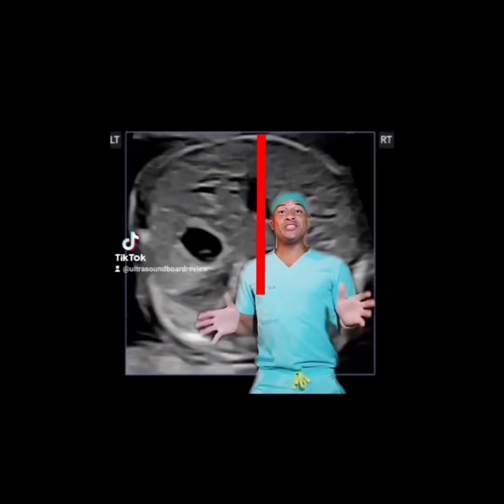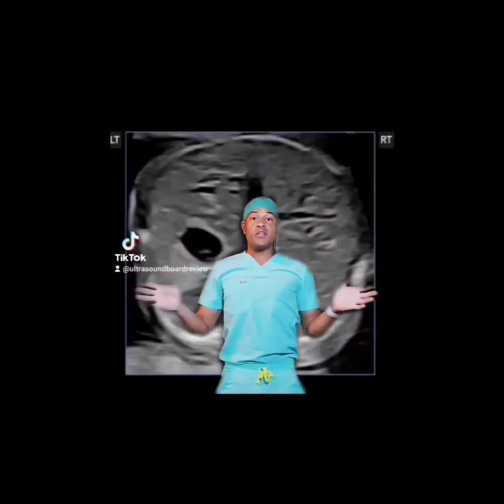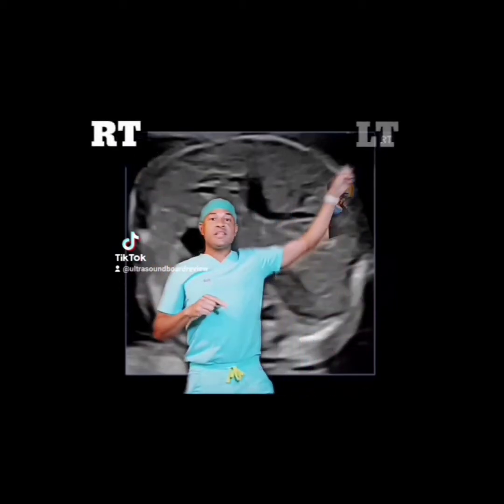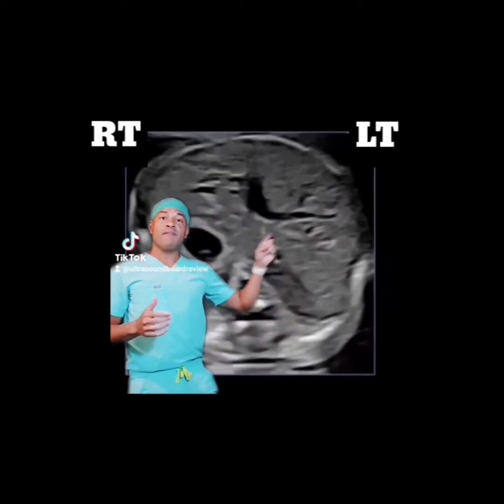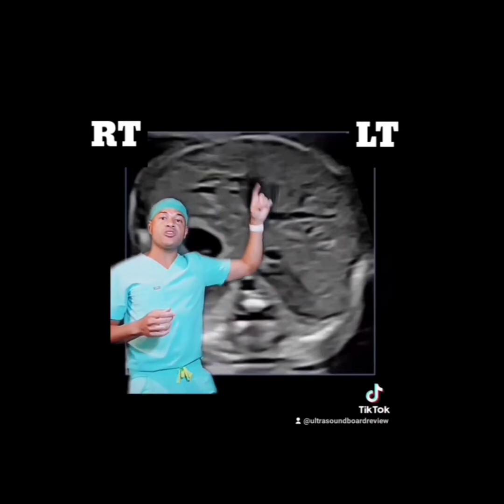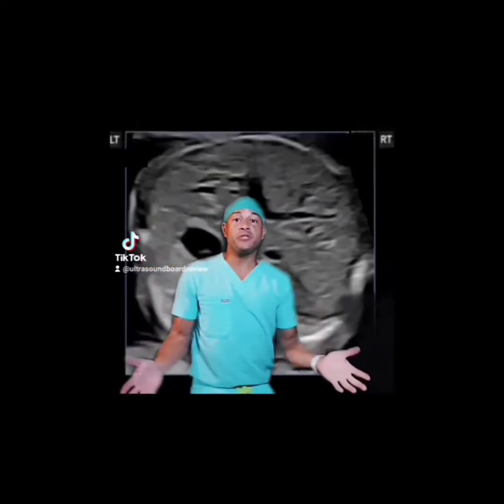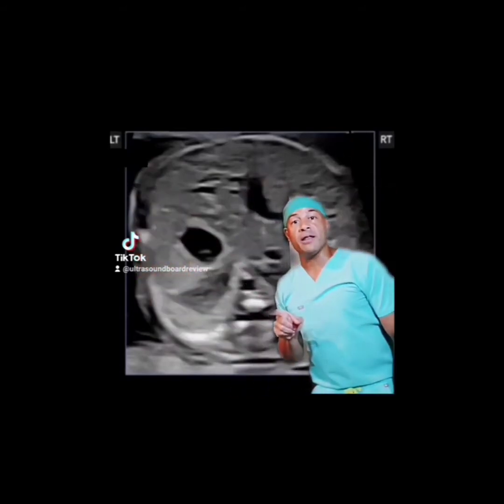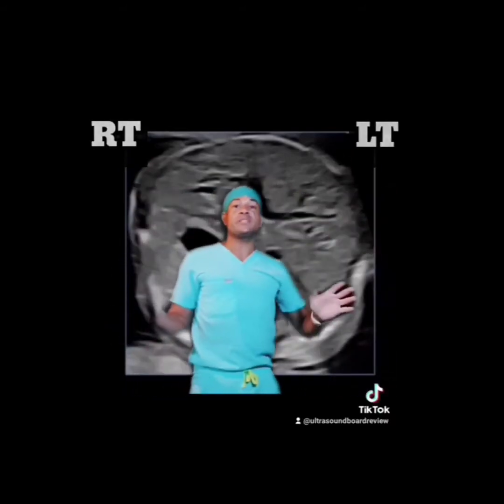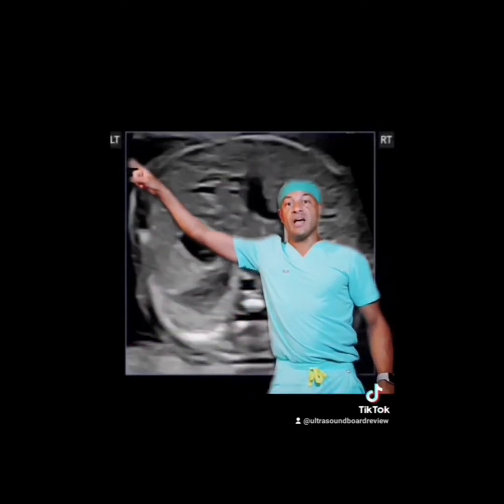So this can't be a breech solely based on the spine's position and the left and right marker. If this was a breech, let's say this was the right side, this is the left side, and the spine was in the same position, so the fetus is still on its back, you would have the stomach on this side, the portal sinus would be an L shape directed towards the right side. In addition, you'd have the IVC on the right side and the aorta on the left side. This can't be a breech presentation solely based on the left and right marker and the position of the spine. This can't even be a breech presentation with situs inversus because the stomach is labeled on the left side.